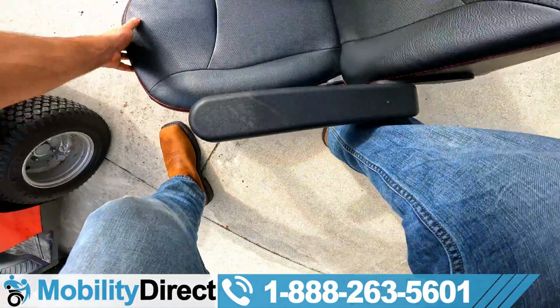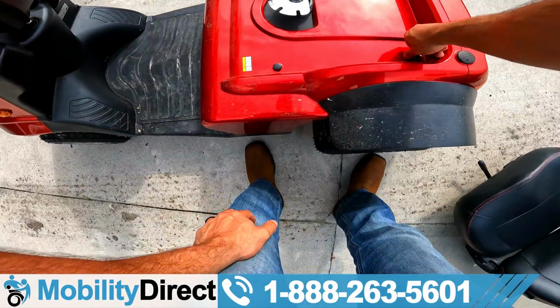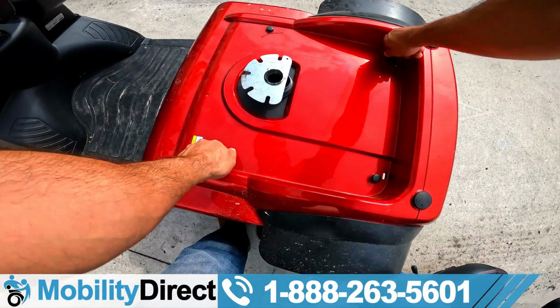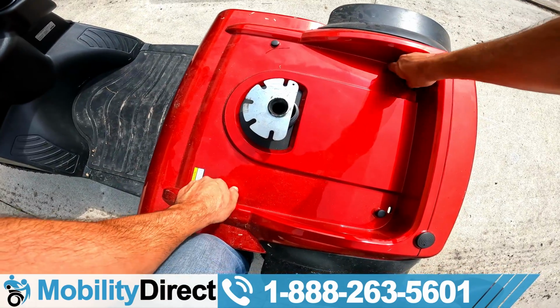Now, what we're gonna do next is take the shroud cover off. That's this whole red body panel, the colored panel. There's some little hand screws here. We got one here, and basically one on each corner. So you want to loosen those up all the way.